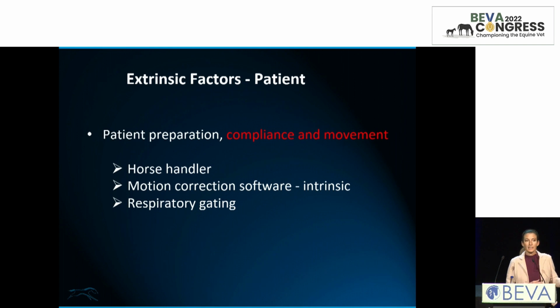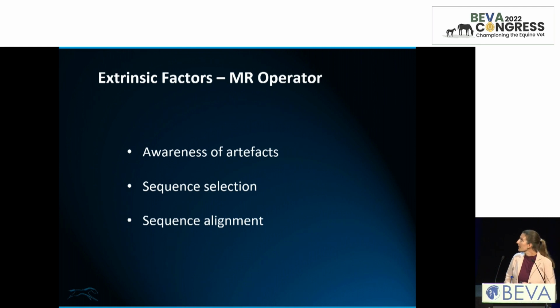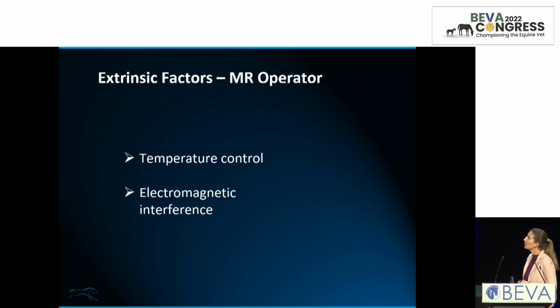Motion correction software, an intrinsic part, but probably for the people who are scanning with low field scanners with standing sedation, one of their best friends, certainly the motion correction software. Respiratory gating, on the other hand, with general anesthesia, may be something that comes in handy to avoid those big movements. The MR operator, also a very, very important person, and I think it starts with simple things.